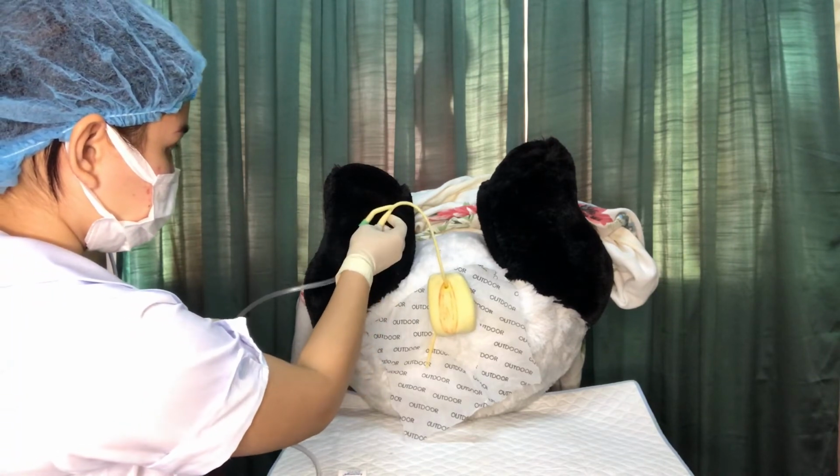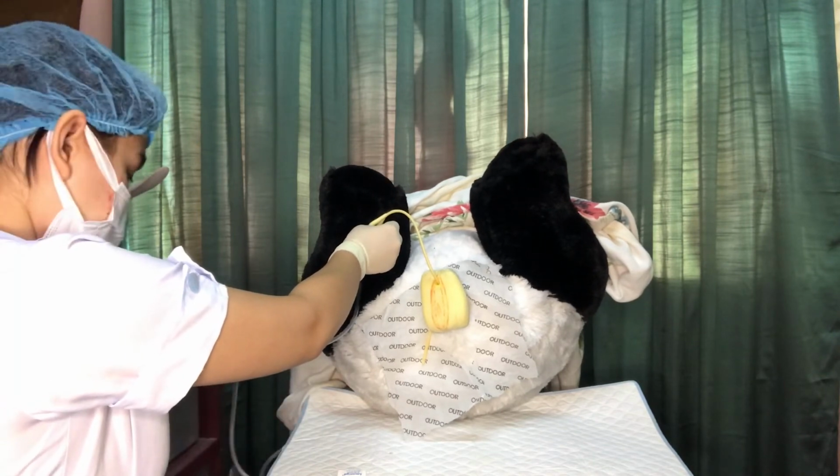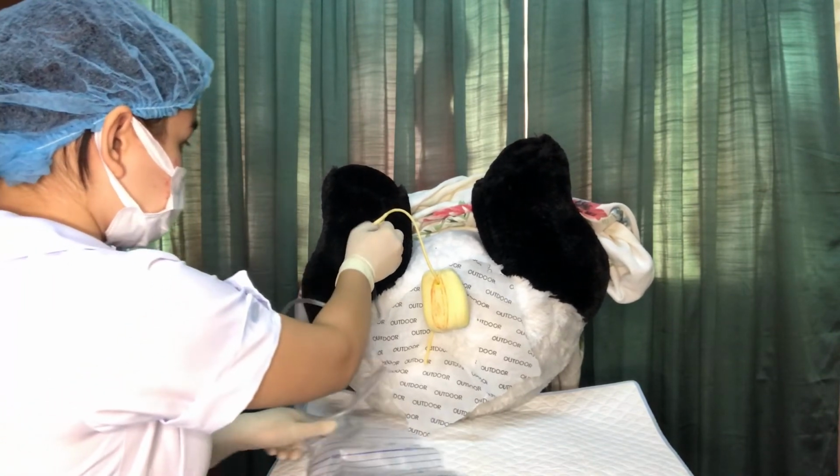Here, a reminder: you are going to place the tubing not under but above the legs of the patient, so it will not give pressure.